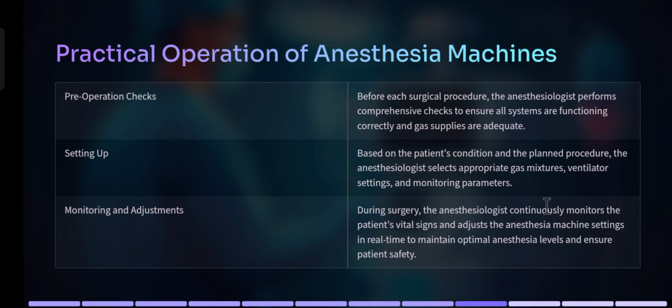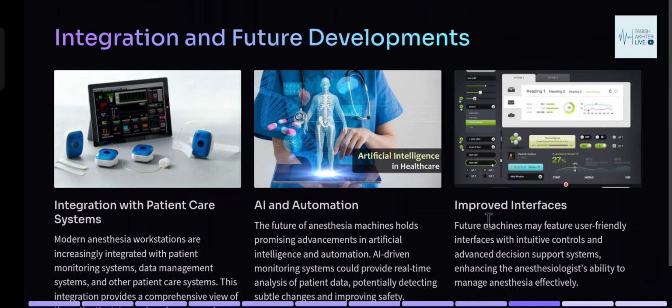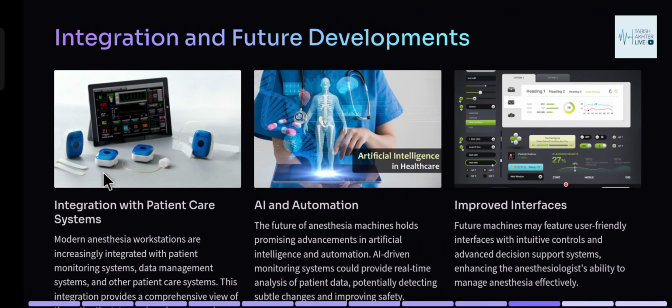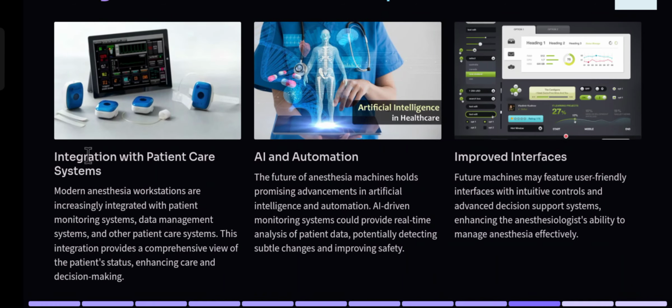Slide 9. Integration and future developments. Integration with patient care systems. Modern workstations are increasingly integrated with patient monitoring and data management systems, providing a comprehensive view of the patient's status.